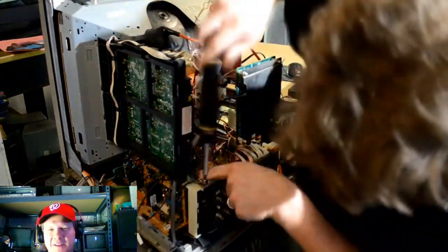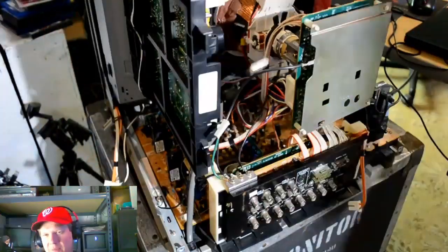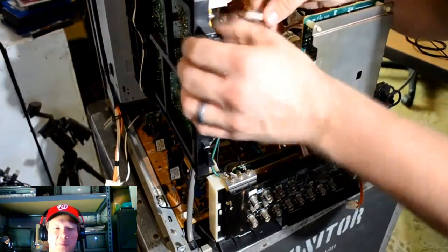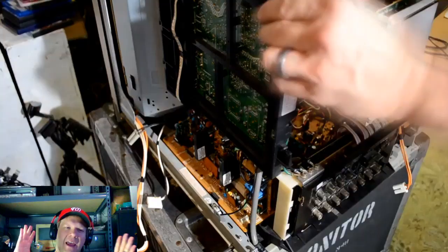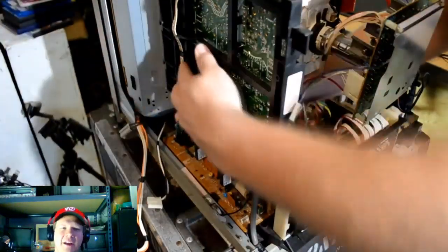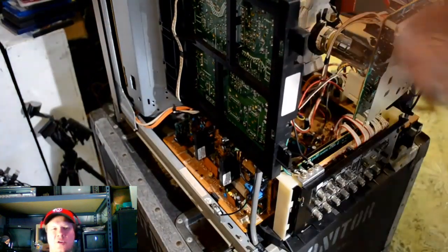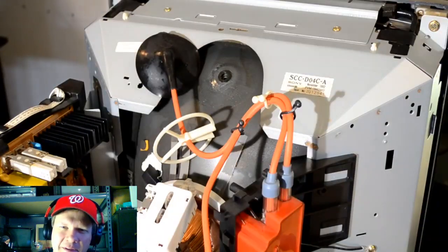Lots of wires, lots of boards, and lots of old plastic that could crack and break if you didn't specifically unscrew everything, or, you know, you could bend and even crack a circuit board, which would cause all kinds of trouble. So anyway, I will tag those videos again up top, and it is about an hour and a half of me tearing down this monitor live. And then I do also have a secondary video following up with that that shows the boards, and I discuss how I made my individual cap kit for this monitor.